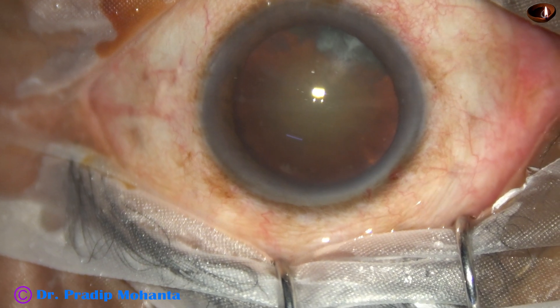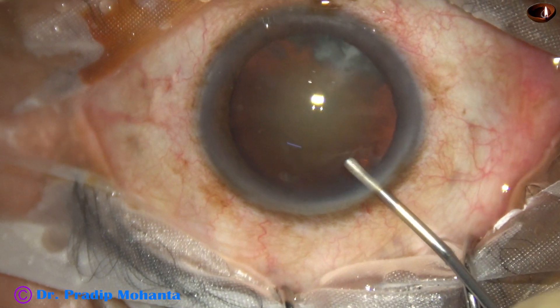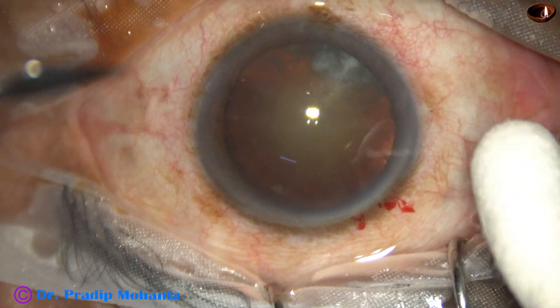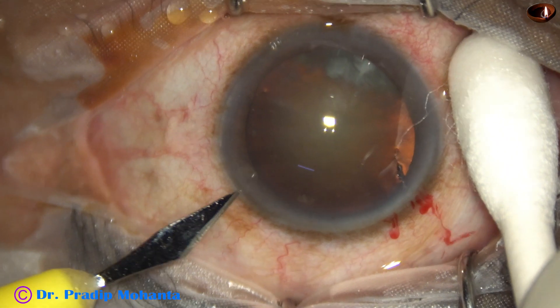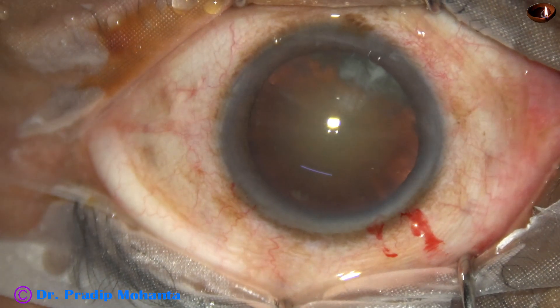Now the main incision has been made with a 2.8 millimeter steel keratome. The anterior chamber is filled up with 2% hydroxypropyl methyl cellulose, and now a side port is made on the left side of the main incision, about three clock hours away.